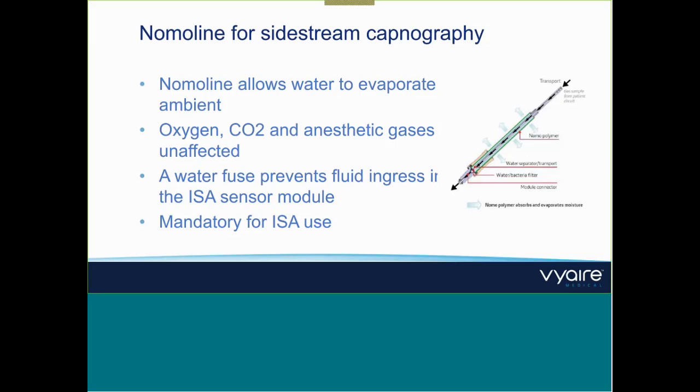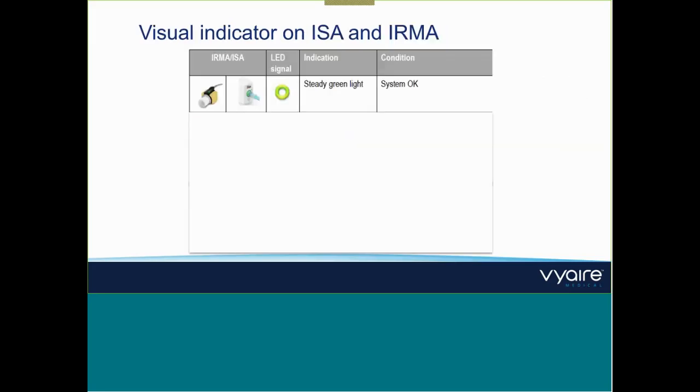So this maybe needs to be changed during ventilation, when you ventilate over days, from time to time, especially when there is lots of water or nebulization involved. Okay, so now the indicators.